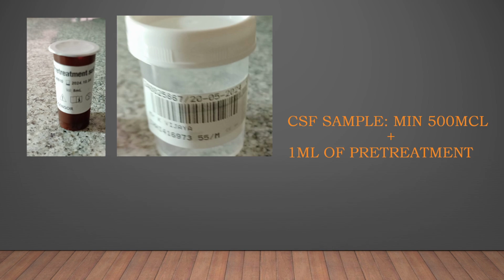If any fluids are there, always make sure that you centrifuge it and take the sediment. Don't run it right away. If it is a sputum sample, try to take the sample which looks good. We may have to pick up the sample.